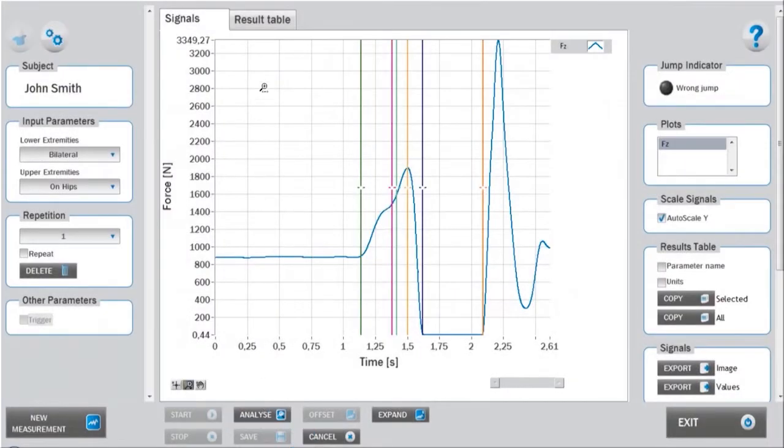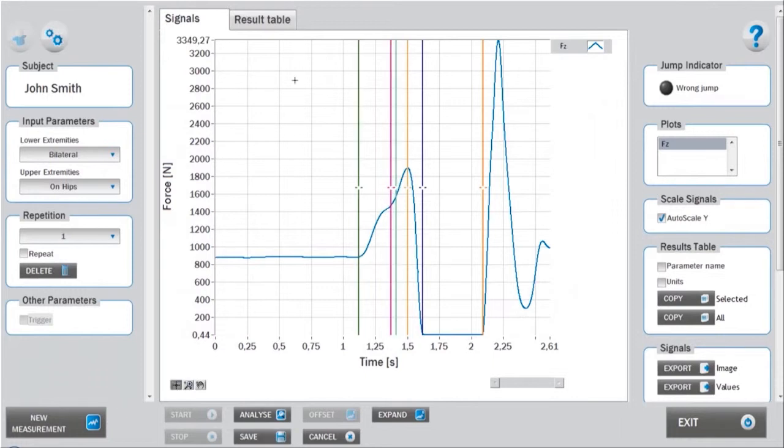The central window displays the ground reaction force signal measured by the force plate. Markers are positioned automatically on the most relevant spots used for analysis.